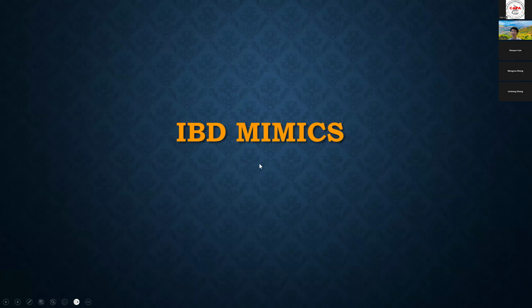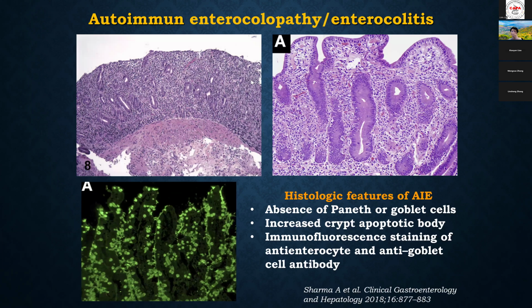Okay, now we talk about IBD mimics. A lot of diseases can mimic IBD. For example, in this patient, you can see there's basal and full-thickness lymphoplasmacytosis. And on low power, the crypt architecture looks altered or distorted. But if you look at high power, you do see a lot of inflammation, but the crypt shows a lot of apoptosis, right? And then we do not really see goblet cells, and we do not see Paneth cells. So this is not IBD.